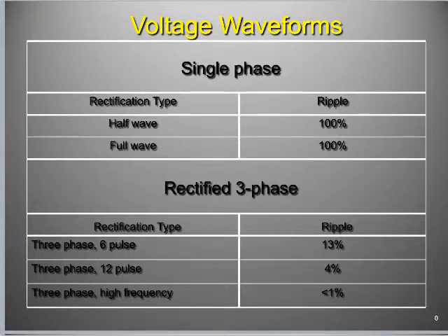So this is fully rectified, 3 phases. A few things that I have underlined here: he does offer some explanations around how the phasing works. I wouldn't get too much into the weeds of it, but basically on page 139, right here, it says 3 distinct sets of electrical current that are sequenced over time such that the pulses of electricity overlap each other. He has a nice little illustration of it right next to it. So we're starting 1 round, 2 rounds, 3 rounds, and we're getting these phases of pulses now.